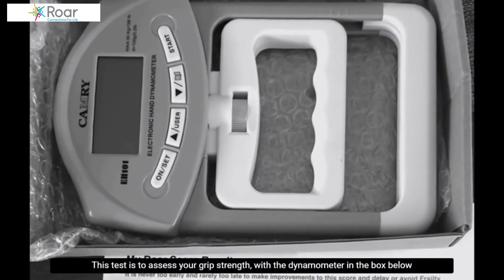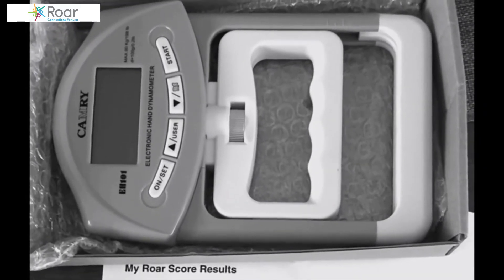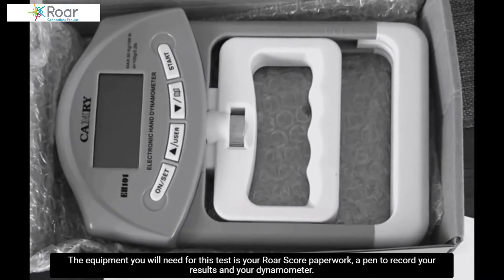This test is to assess your grip strength with the dynamometer. The equipment you will need for this test is your RORScore paperwork, a pen to record your results, and your box dynamometer.